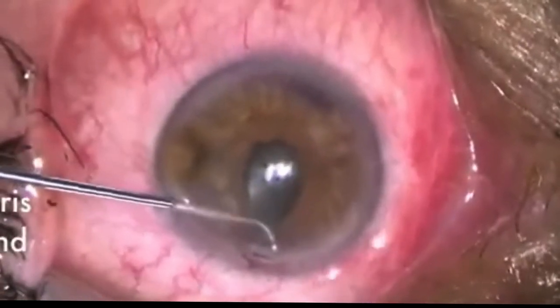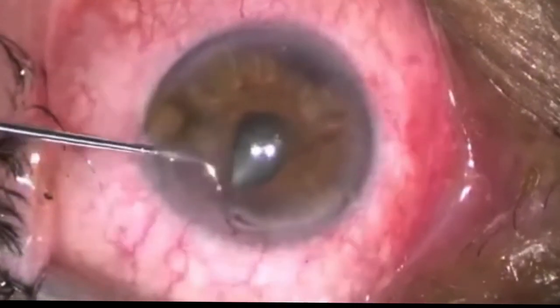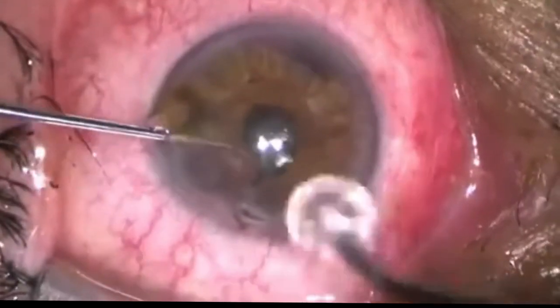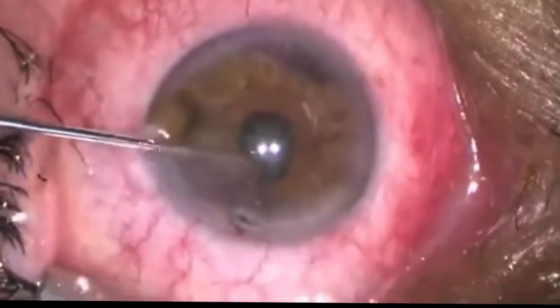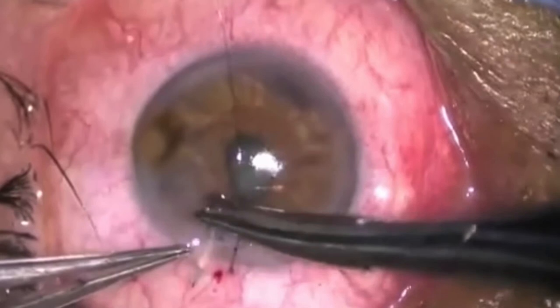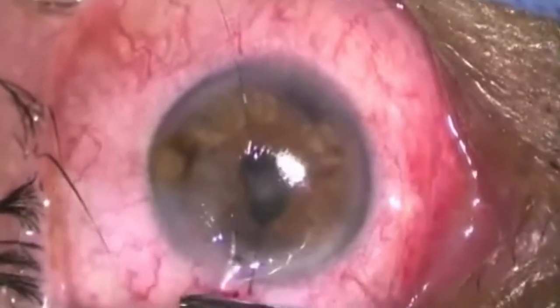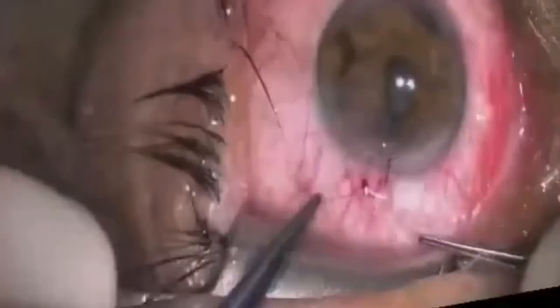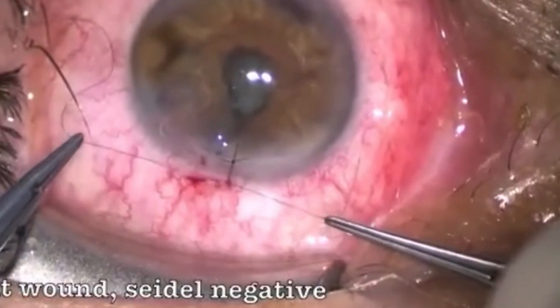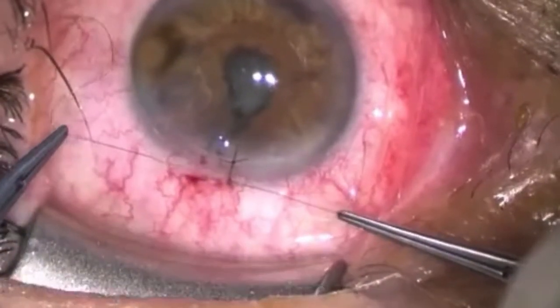The iris was returned to the eye with a little bit of encouragement from the Connor wand and some viscoelastic, and I was pretty pleasantly surprised with how round the iris became. It was a stellate wound, so we did decide to close with a horizontal mattress suture to achieve a Seidel-negative result. And then the biggest project was figuring out what antibiotics we should put this patient on.